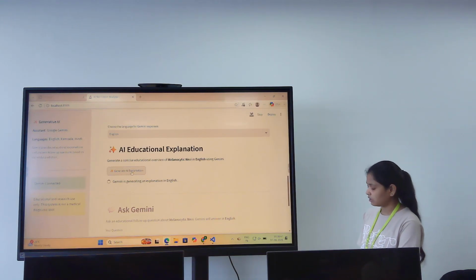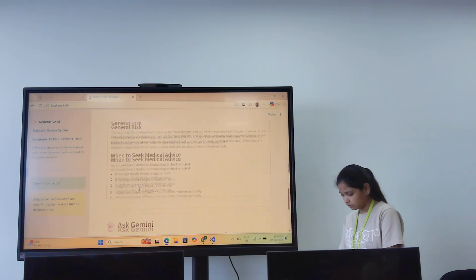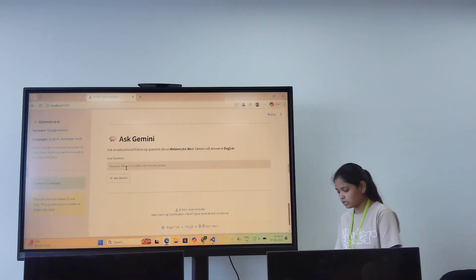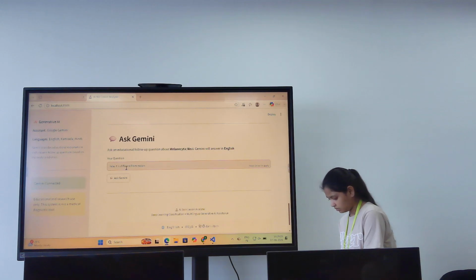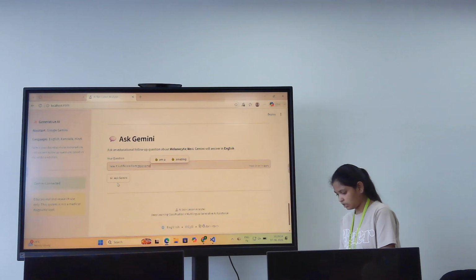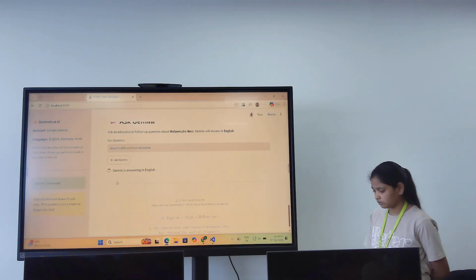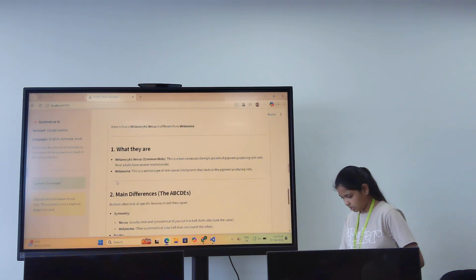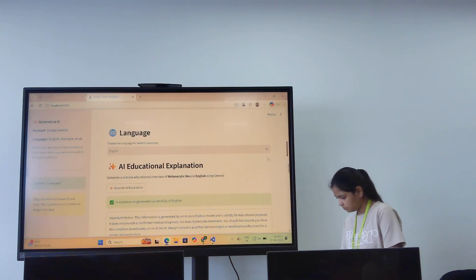Gemini explains the disease in understandable language. If we want to ask any questions, we can use Gemini, like how it is different from another disease. Melanoma is also one of the diseases. Here it gives the answer. If we switch the language, Gemini gives the information in Kannada. Now it gives it in Kannada.